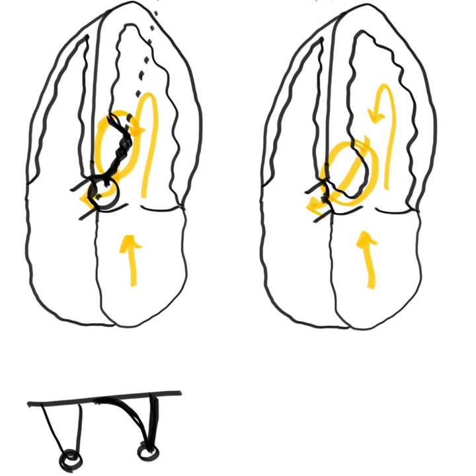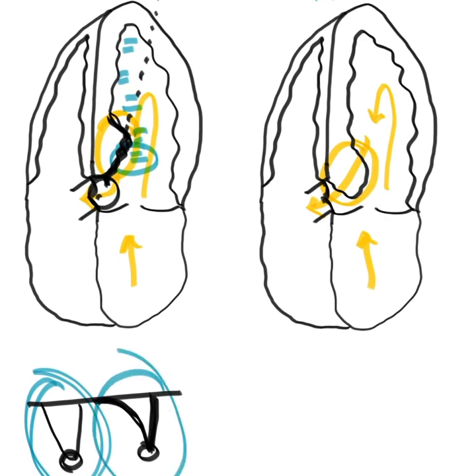So if you see the dynamic gradient on your echo, your next step is to do what we call pulsing down the cavity. So you got your dynamic gradient on continuous wave. Next, you're going to take your sample gate and you're going to pulse down it. So you're going to pulse here, you'll get your normal waveform. Pulse here, normal waveform. And you'll keep doing this until you get to the area, which is probably going to be about right there on this example, which is going to give you your dynamic gradient.